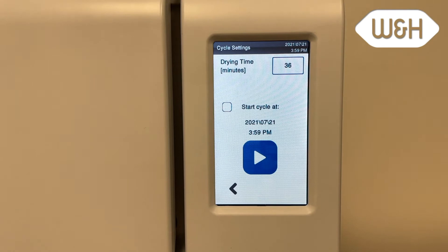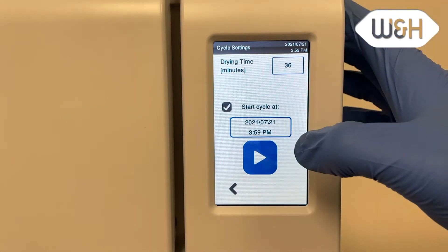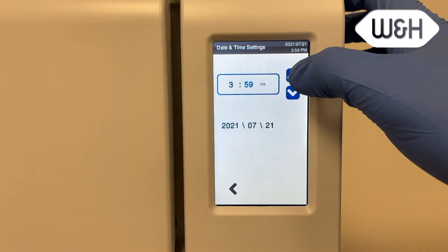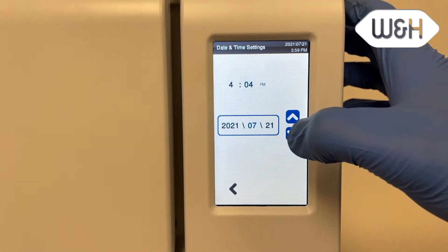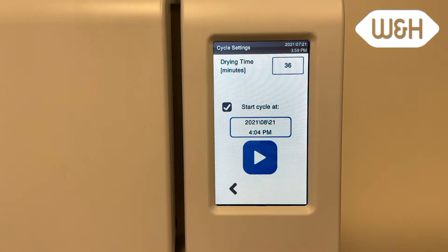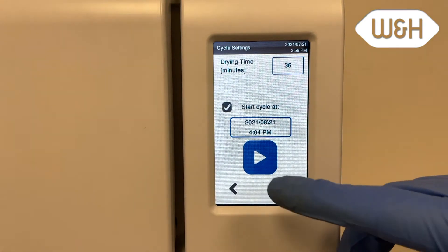There is also the option to start the cycle at a later time. Confirm your settings, then press the start button to begin a new cycle.